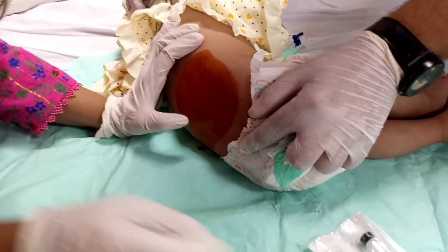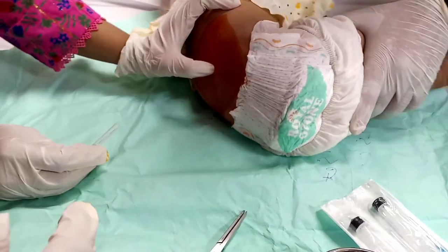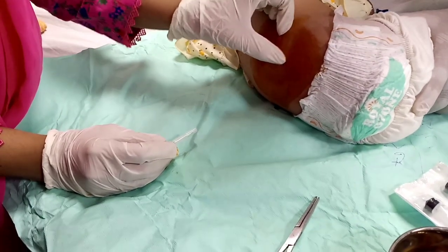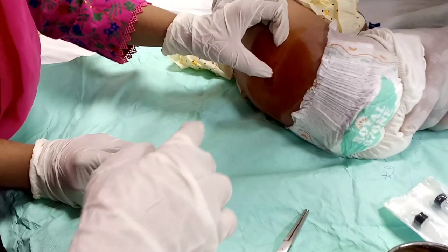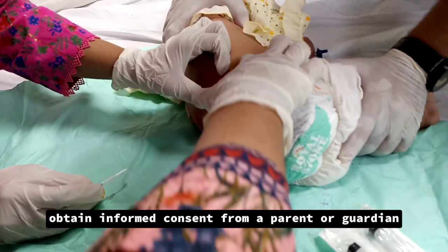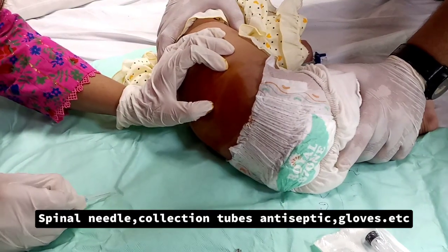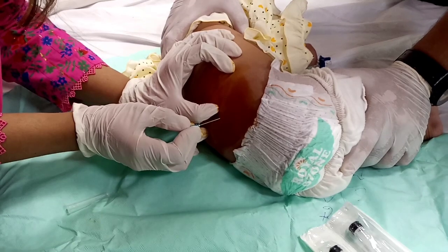Here are some key points related to LP. Indications include the need for CSF collection, suspected meningitis, and encephalitis, or administration of medication. Preparation: obtain informed consent from parents or guardians, and ensure all necessary equipment is available — spinal needle, collection tubes, antiseptic, and gloves.